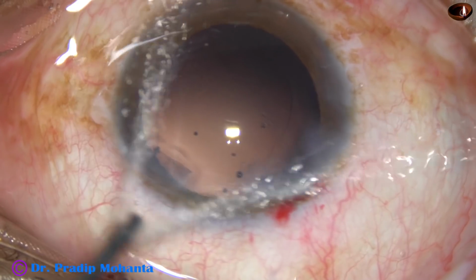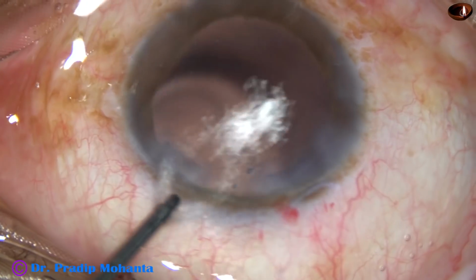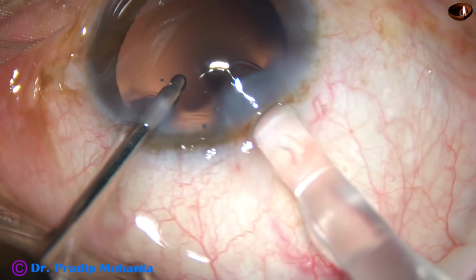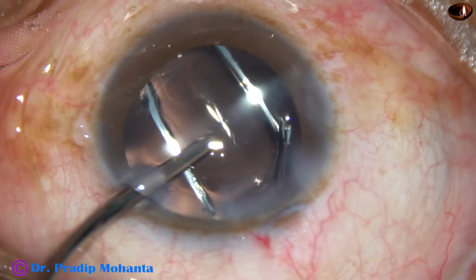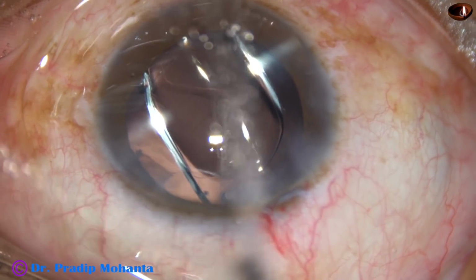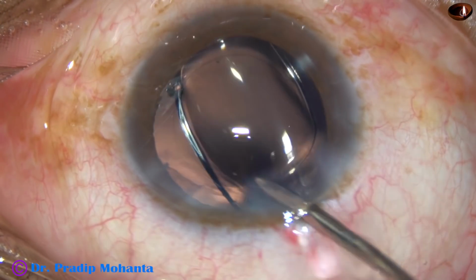Cortical cleanup has been done, and this is hydroimplantation. The anterior chamber is kept formed by the irrigating probe, and the lens is injected into the capsular bag. The leading haptic goes into the capsular bag, and the trailing haptic is pushed into the bag by the left hand instrument. And now the irrigating probe is introduced through the main incision.